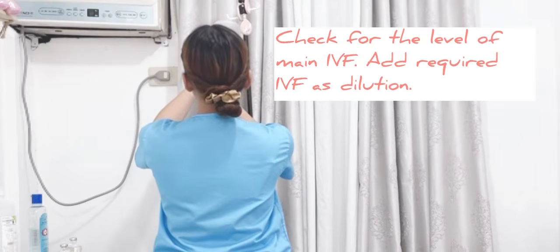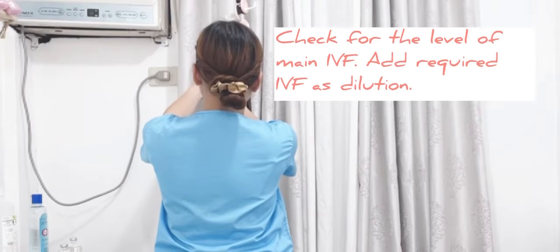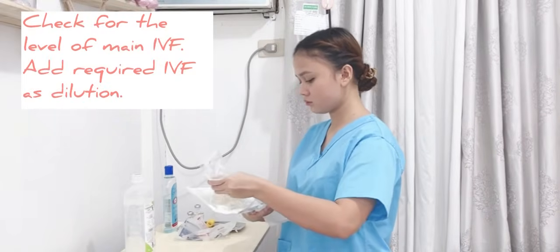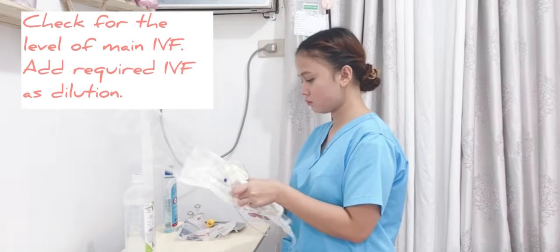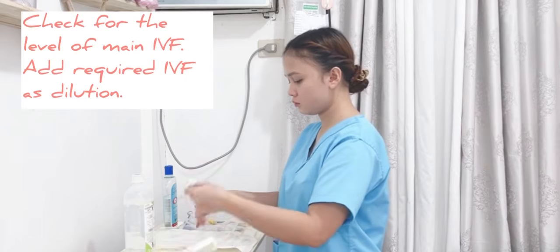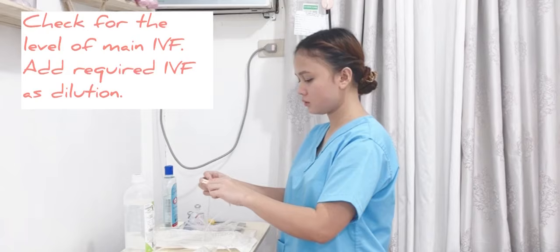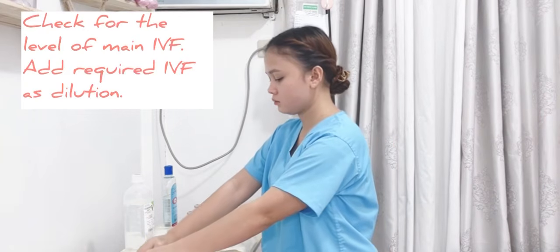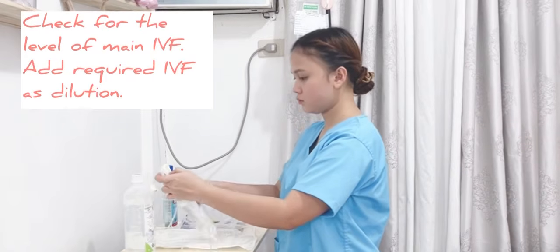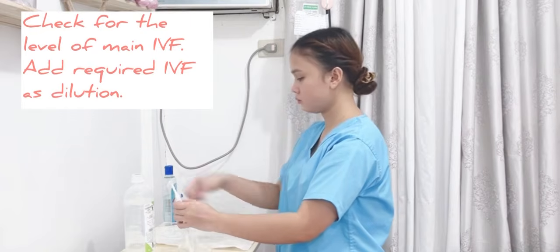First is to check the level of the main IVF and add required IVF as dilution. Then first, open the Soluset. Then clamp first both the upper and lower roller clamp. Then remove the cover of the spike.